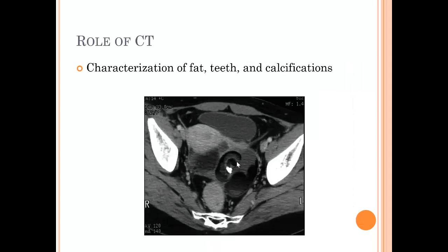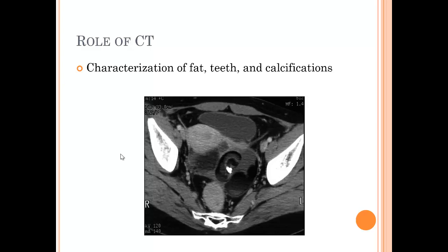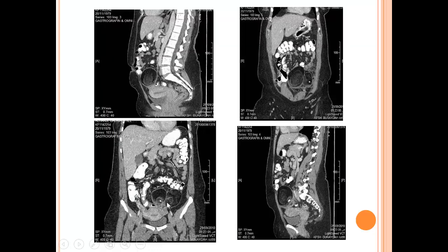The role of CT: CT is very important for characterization — the presence of fat, teeth, and calcification. Here we have a complex adnexal lesion in the left adnexal region. You can see the different components: fat component similar in density to pelvic fat, a fluid part similar to the urinary bladder, and a tooth here. So we can characterize fat, tooth, or calcification. If you suspect mature cystic teratoma, you can do CT — no need for MRI if there are no enhancing components. This is another case of mature cystic teratoma: bilocular, containing fat contents and a tooth — another typical mature cystic teratoma on CT.